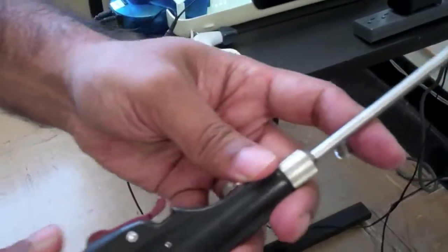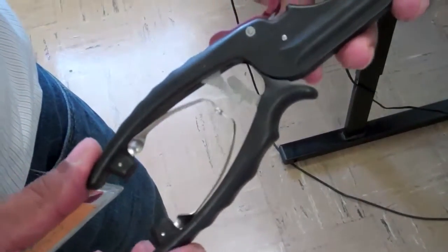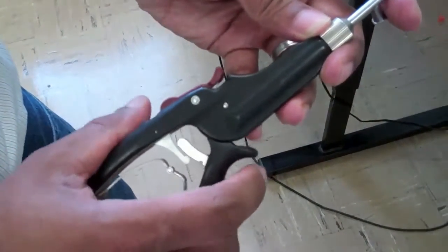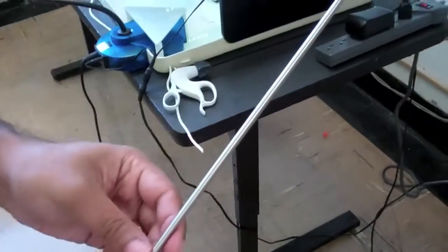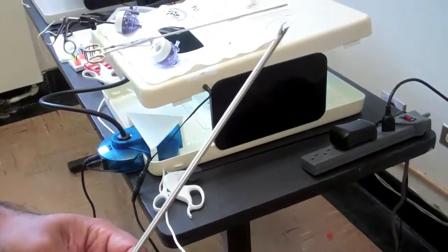The other thing to recognize is that the trigger mechanism is going to be very dependent on the style of needle driver. They have inline needle drivers, they make pistol needle drivers that kind of come off at an angle, and sometimes the trigger is here at your thumb, other times the trigger is at the bottom. But the important thing is to know how your instrument is aligned so that you can always keep the static blade on the bottom and know where your trigger is located.